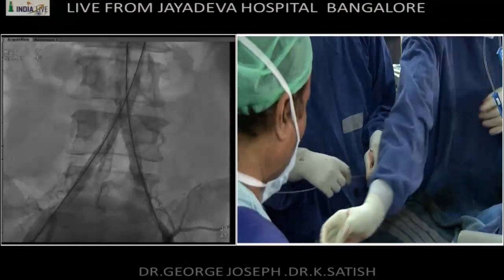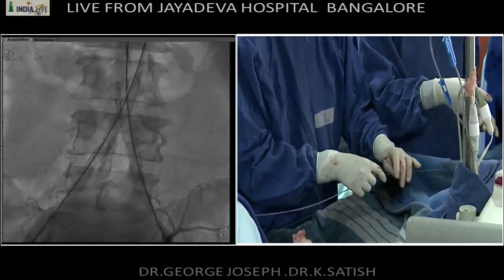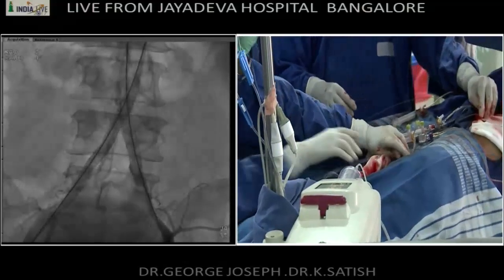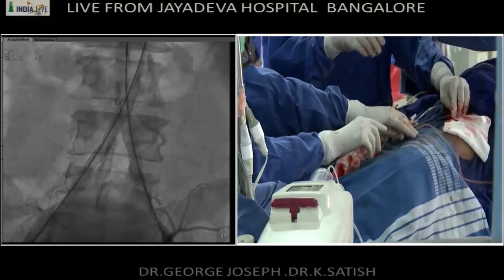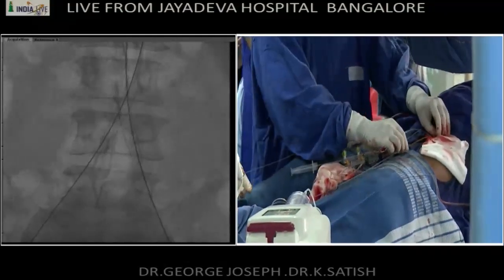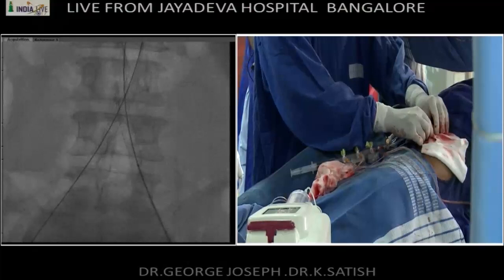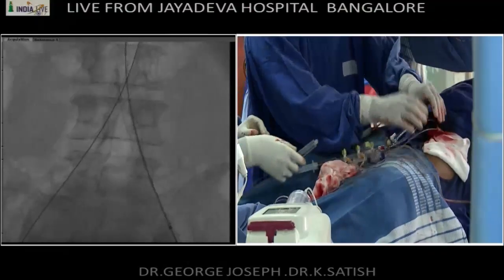Dr. Khanna, don't you think that the proximal double barrel is too much into the aorta? I think so. I would have kept it as low as possible, or do a stent for the aorta and then create a carina, because otherwise take two self-expanding stents, so they don't have this potential space. If you have to do it like this, probably two bigger stents like 10 or 12 millimeter would completely cover the aorta. Contrast. Okay, sure, lower down.